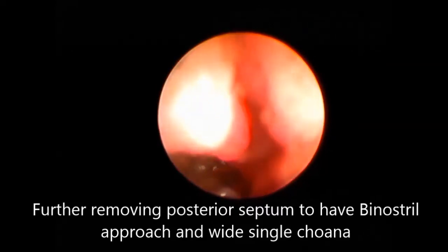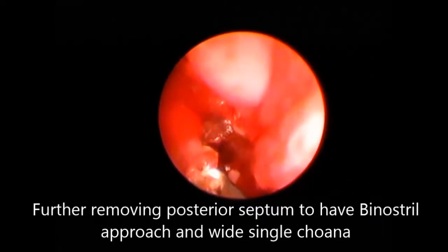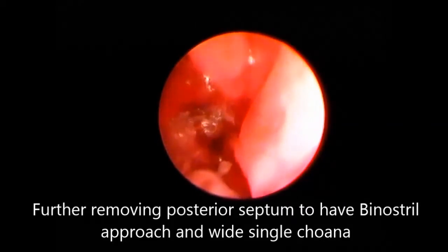Some role of mucosal flaps and their preservation has been explained in theory, but it was difficult in this narrow cavity.